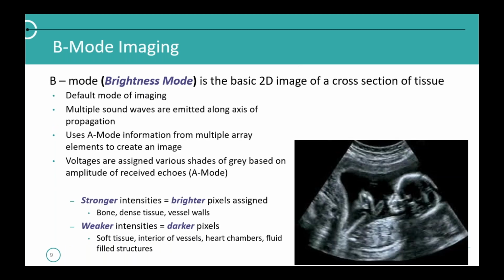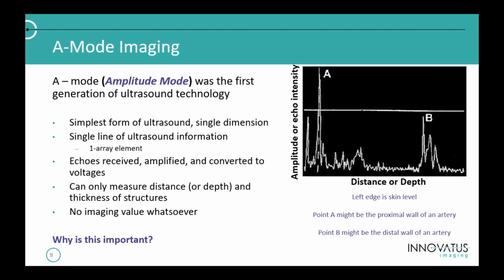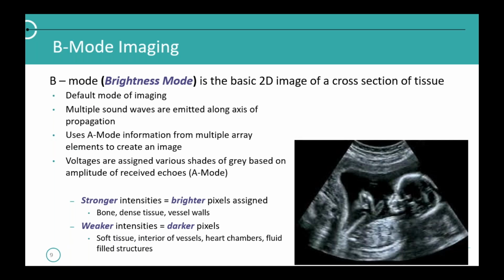B-mode imaging is the type of imaging that's most common. You turn on a scanner and this is what you see, B-mode imaging, or brightness mode. It's the default mode of imaging. And so what we're looking at is this uses multiple lines of A-mode imaging that are lined up, stacked like a loaf of bread next to each other to make this image right here. Instead of looking at amplitudes and blips on the screen, we convert these amplitudes into various shades of gray. So something with high amplitude would be white, something with low amplitude or weak signals would be black or darker shades of gray. So that's where the A mode comes into all of this. But that's how this works.